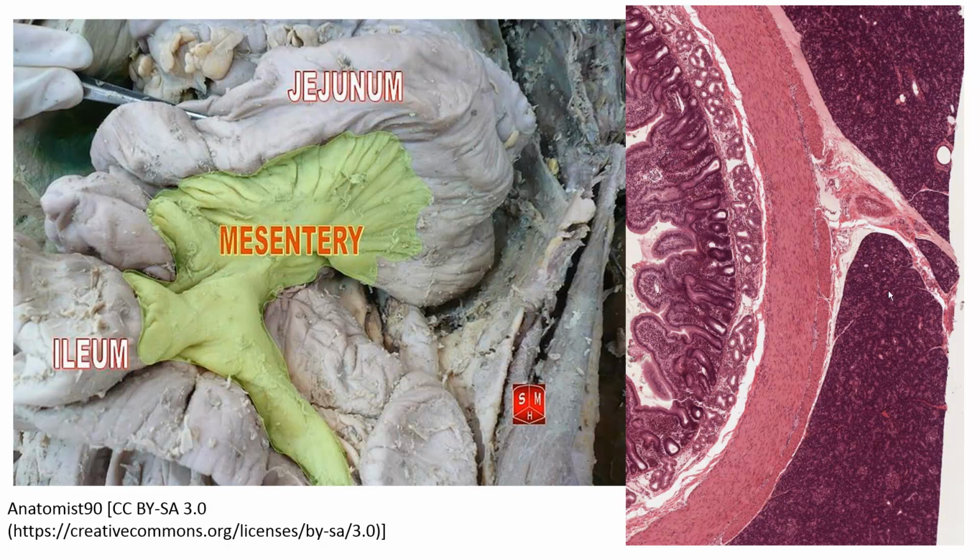So if we look at the light micrograph on the right, you can see the mucosa, farthest on the left, submucosa, muscularis externa, and here is the serosa. So here's the inside of the serosa. I'll mark off the border between muscularis externa and serosa. But see how the serosa gets pinched out here? This outpinch structure is the mesentery. This is this membrane that we're seeing over here. And it is from the mesentery that your intestines are suspended. They're not just hanging out all loose in there. They're actually suspended from the peritoneal wall by this outpinching of the serosa.